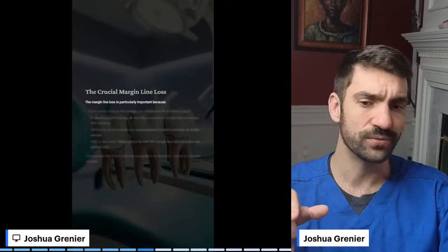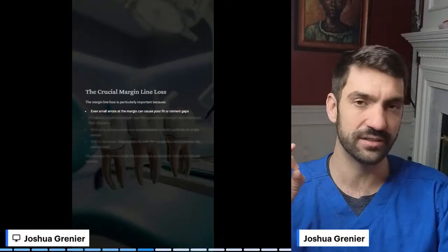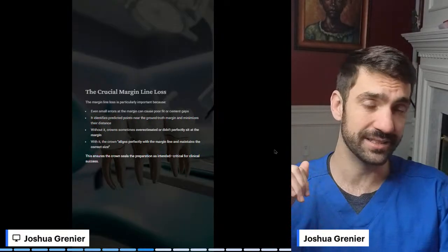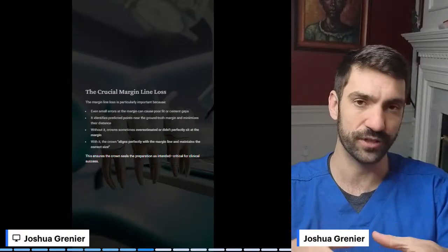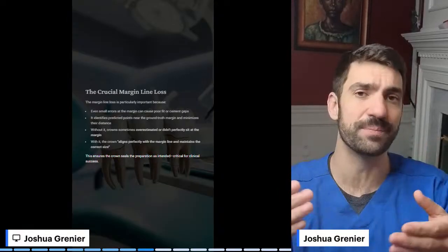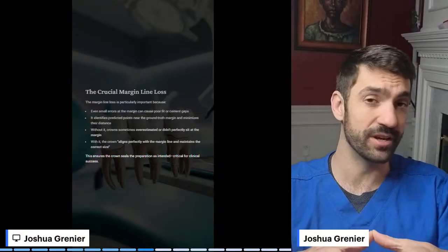This model really tried to zero in on creating a margin line. But I'd kind of foot stomp this, because they used a ditched and dyed scan model with a perfect margin. In reality, 3Shape sees models that aren't ditched and dyed.